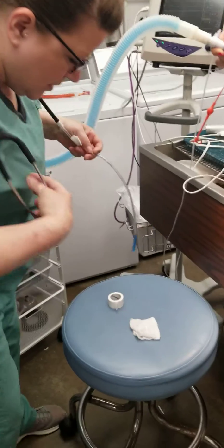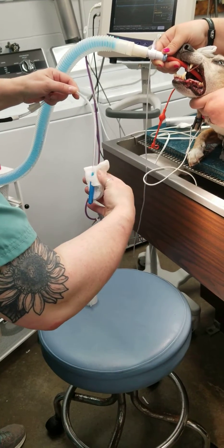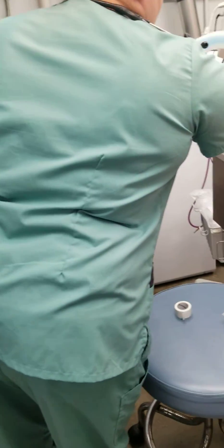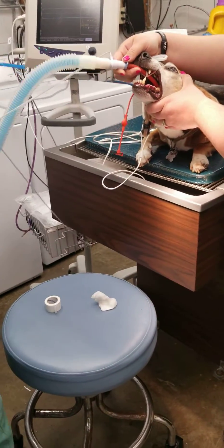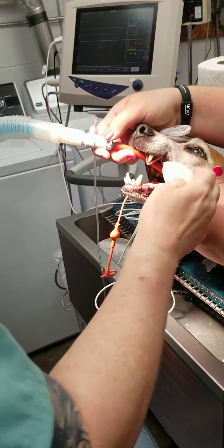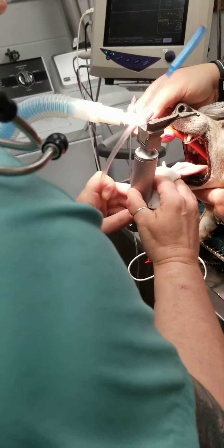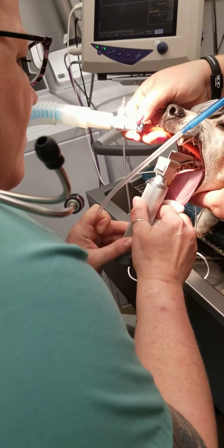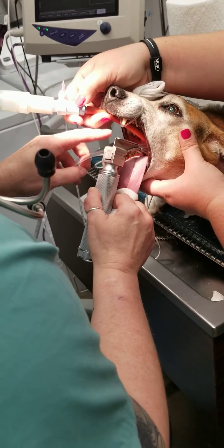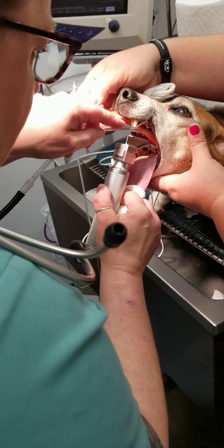I'm going to lightly move the end. I'm going to use my esophageal stethoscope and insert it into where it's marked.